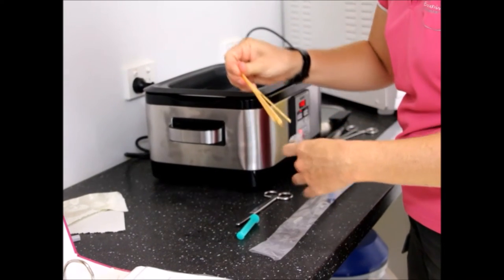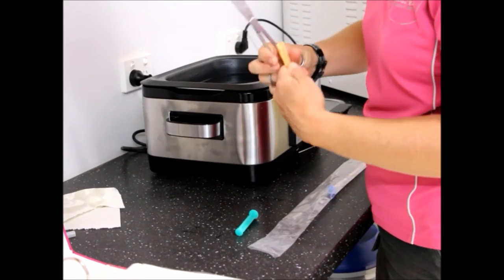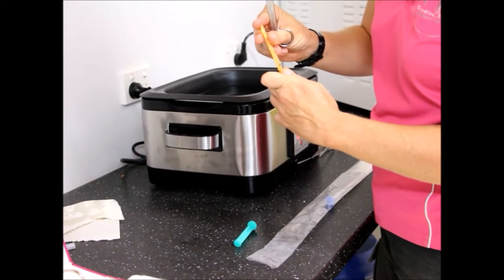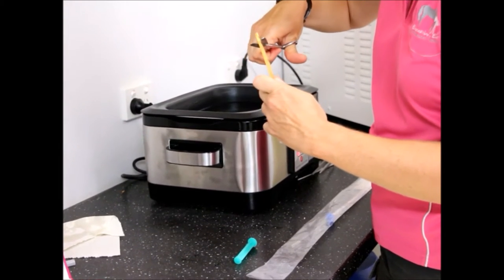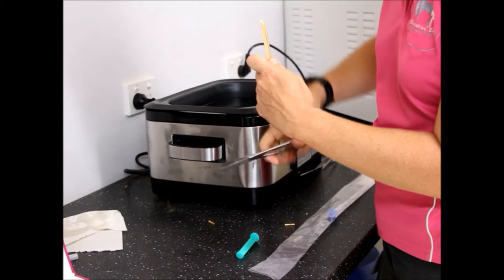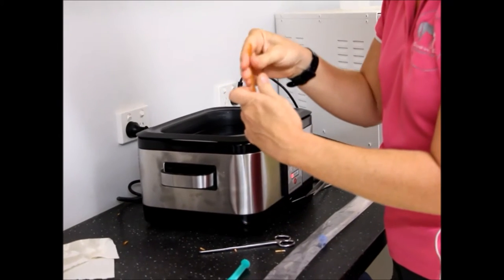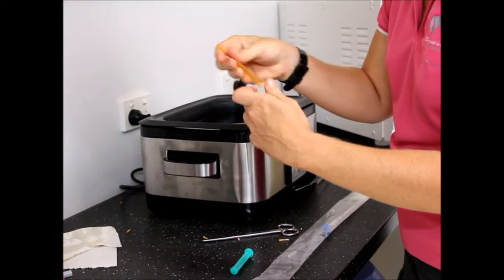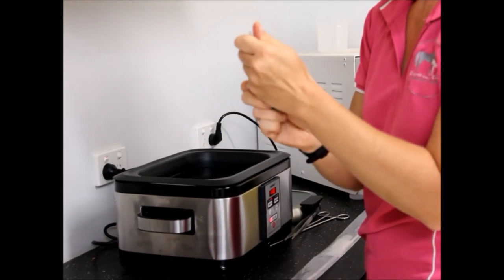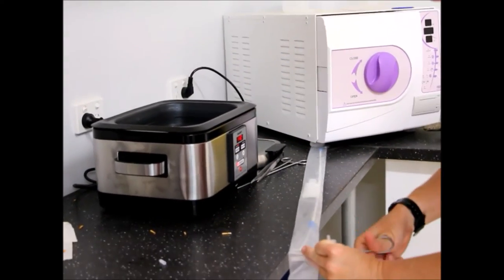We use a deep horn insemination technique at Exclusively Equine, with a longer AI pipette that allows us to get the sperm right up almost to the fallopian tubes in the mare's reproductive tract, so the sperm don't have to swim too far and waste too much energy. Once the straws have been deposited into the syringe, we replace the stopper and make sure we get every drop out of those straws. We then protect the semen from light and load it into our AI pipette ready to inseminate into your mare.